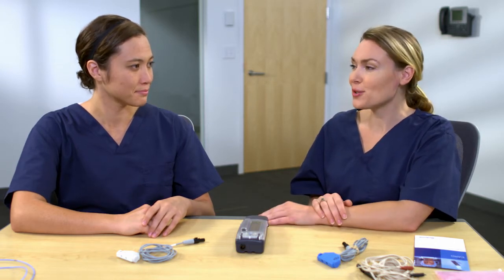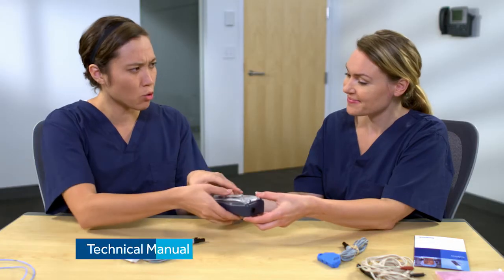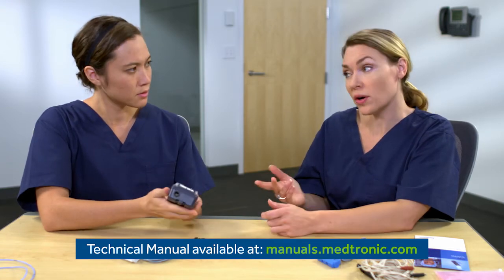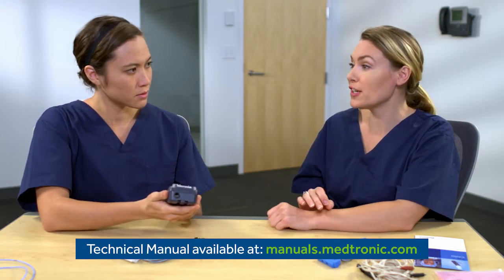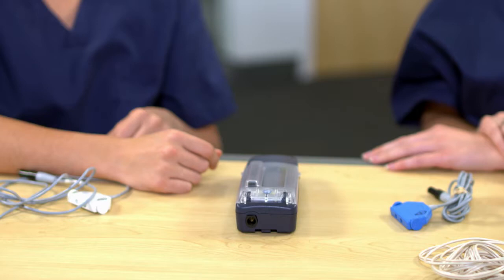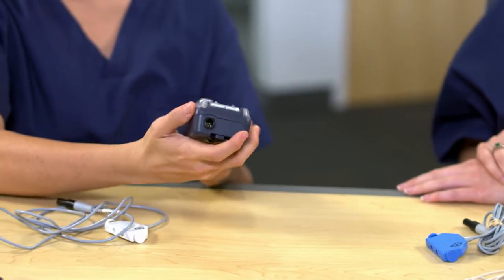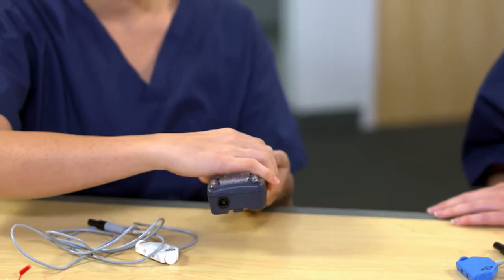Now let's talk about getting ready to use the device. There are some checks you'll need to do before you use it. First, make sure the device is clean and disinfected according to your organization's policies. You can refer to the manual or go to Medtronic Academy for a video on cleaning. Next is the service check to make sure the device and cables are free of any defects. You'll need to examine the device to ensure the functionality of the controls and that the battery drawer closes properly by hearing that click.